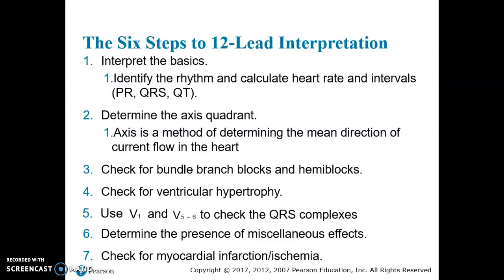When we're looking at the QRS interval, a prolonged QRS interval can imply a ventricle rhythm problem. A prolonged QRS can imply that something's going on in that ventricle. If we have a block of the bundle branches or electrolyte imbalances, this could show as well in those QRS intervals. A prolonged QT interval is a herald for lethal arrhythmias. So if we have a prolonged QT, then we need to be thinking about what's going on in those ventricles, because it can lead to a lethal arrhythmia and be deadly.